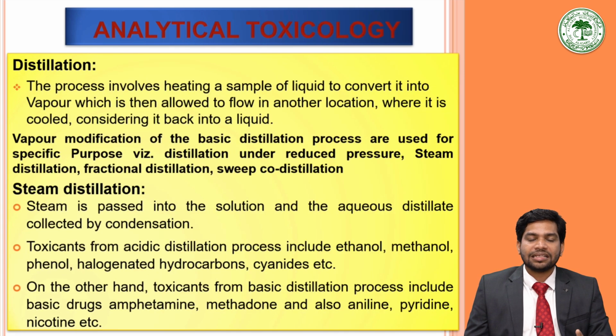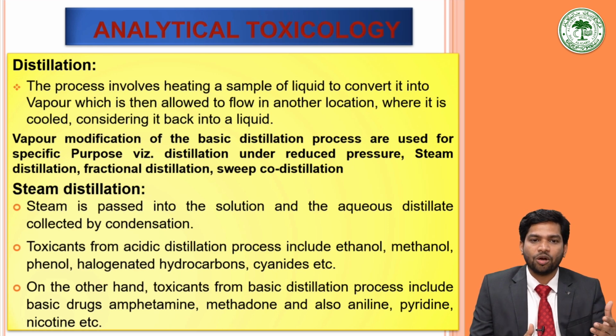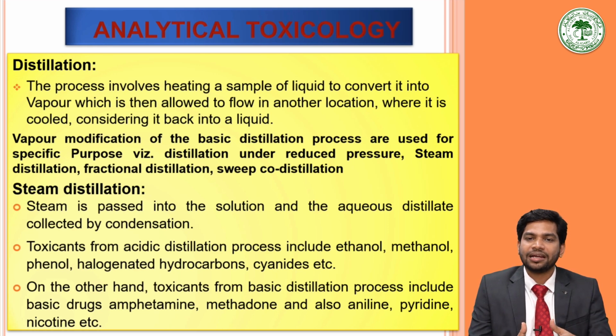Then another technique is distillation. The process involves heating a sample of liquid to convert it into vapor, which is then allowed to flow to another location where it is cooled and brought back into the liquid form. So, here some of the solute may remain in the jar or some of the solute may go with the liquid. In this way, we may separate the different solutes. The distillation method is very commonly used in chemistry laboratories. So, you all must be aware of this method.